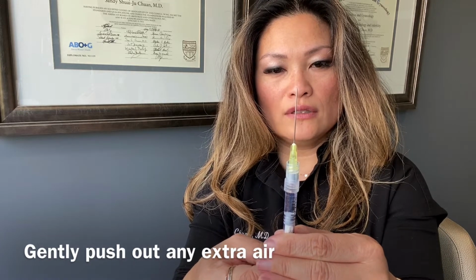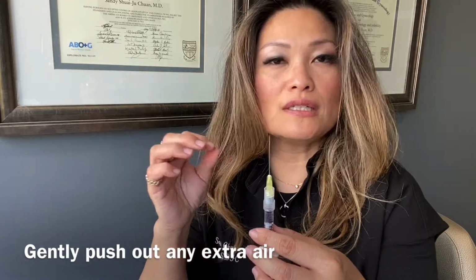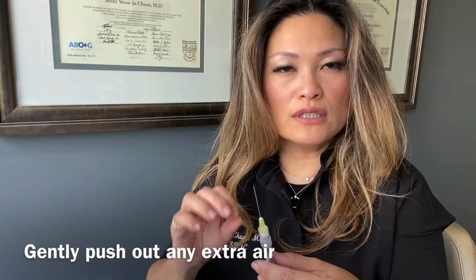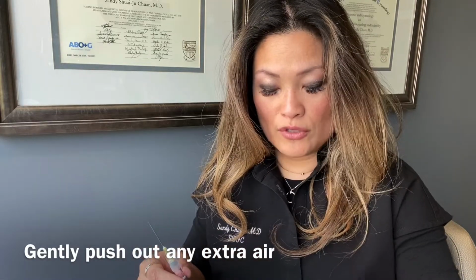And if you do have a little tiny bit of air, it's not going to be harmful. If you just can't get it out, that's okay, because a little bit of air is okay. You're not injecting into a vein or into an artery, so a little bit of air into the skin is totally tolerable. Just a tiny little drop, you're going to see that sometimes, okay? So I don't want you to be nervous about that.